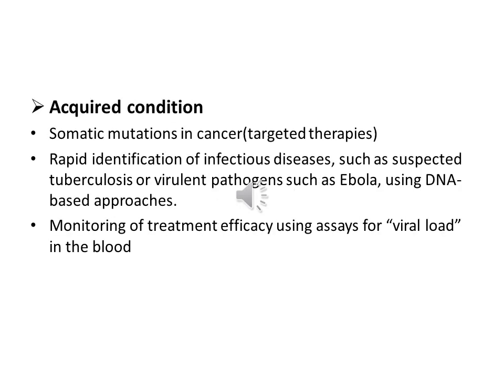Molecular diagnostics are used to identify somatic mutation in cancers and also to identify infectious diseases such as tuberculosis, influenza virus, or specific strains such as H1N1 virus. Also, by these methods, we can monitor the treatment efficacy using assay for viral load, or for some cancers, targeted therapy is developed.